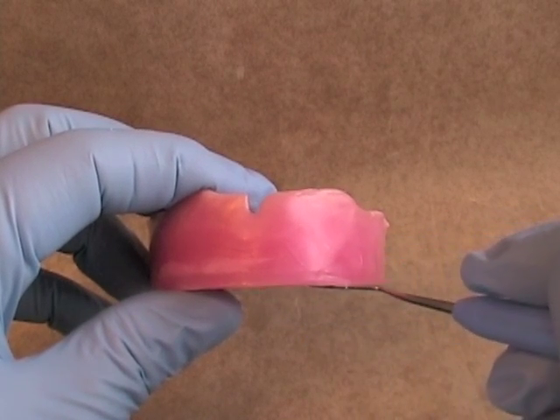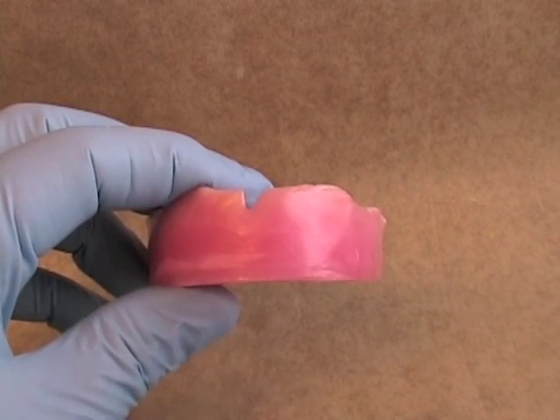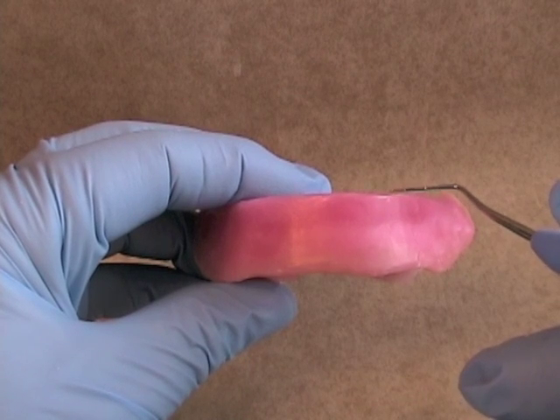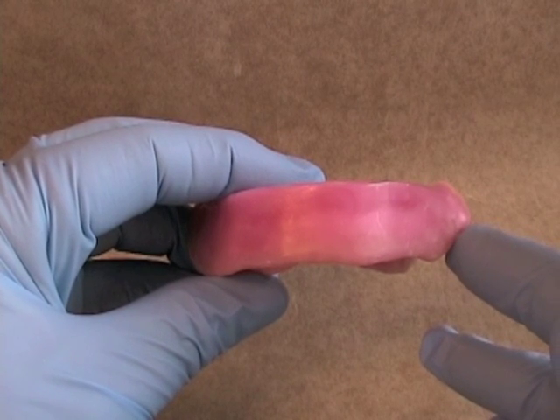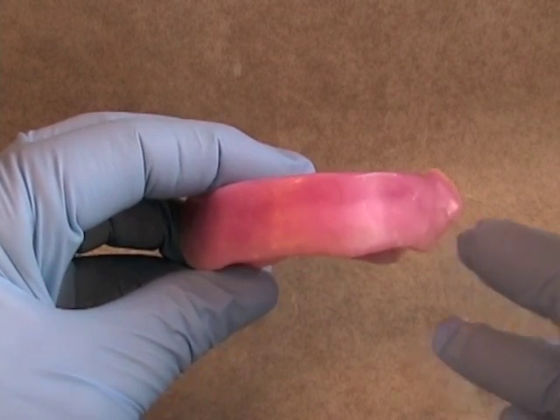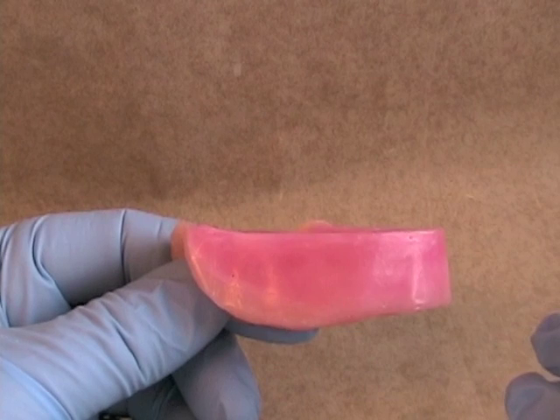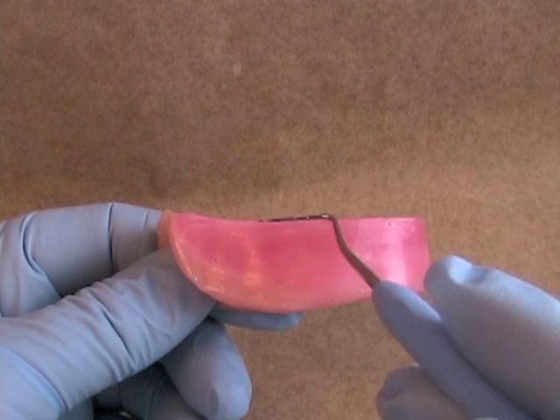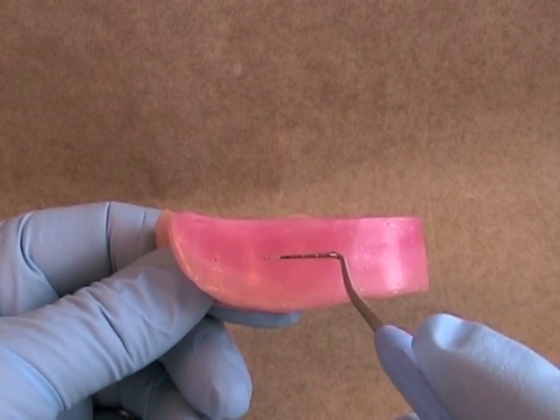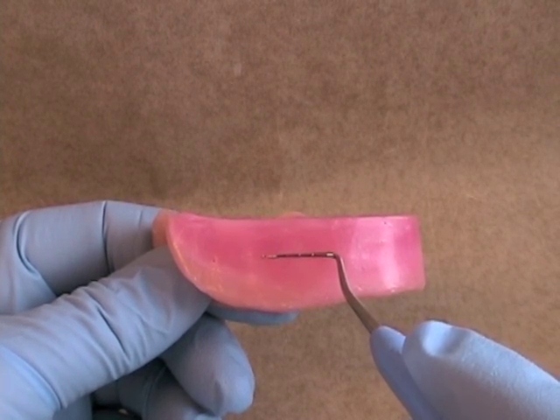The angle of the occlusal plane on the rim should be parallel to the patient's interpupillary line. At rest, the occlusal plane of the mandibular rim should be at the level of the corners of the patient's mouth. Posteriorly, the edge of the occlusal plane should intersect somewhere around halfway up the retromolar pad.